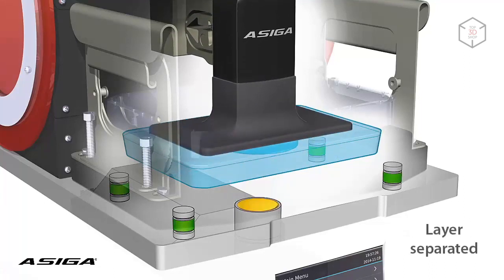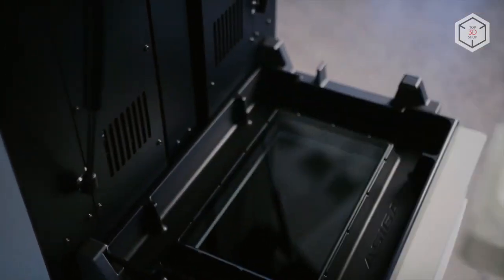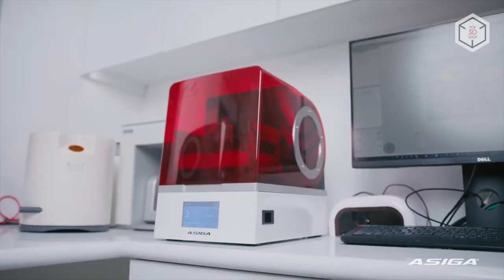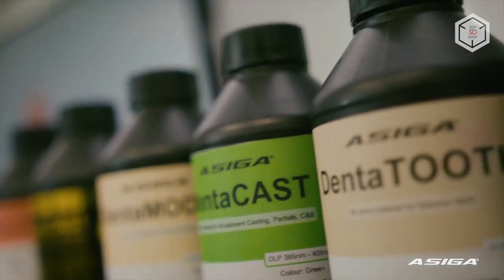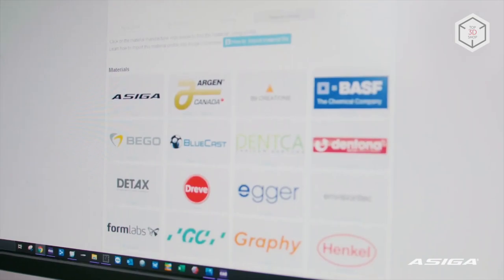The printer can also change the curing time for each layer according to the readings of the built-in radiometer, which measures the cure intensity in real-time. Practical features of Asega printers include quick material changeover — this procedure takes less than a minute. All of the company's 3D printers support both the proprietary range of photopolymers and third-party resins, with compatibility covering more than 500 materials.